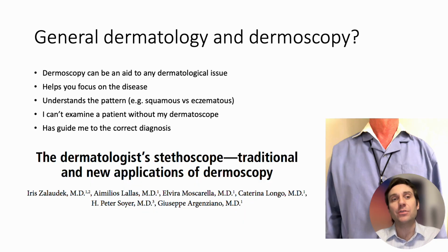And I think it's the same for dermoscopy, right? I think, as this paper shows here, the dermatology stethoscope should be, and it is now to me, the dermatoscope. In general dermatology, and of course in skin cancer, dermoscopy must be part of your daily use. And again, it helps you focus on the disease. It's different to see a patient from far away than to really focus on the patterns using your dermatoscope.